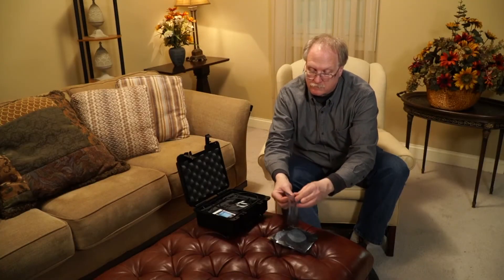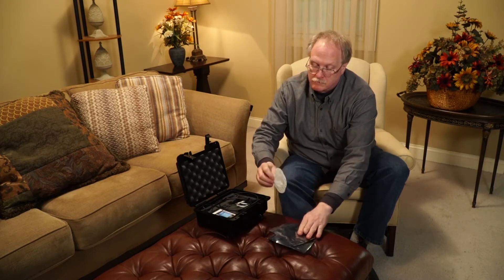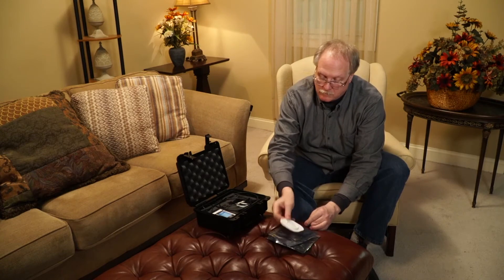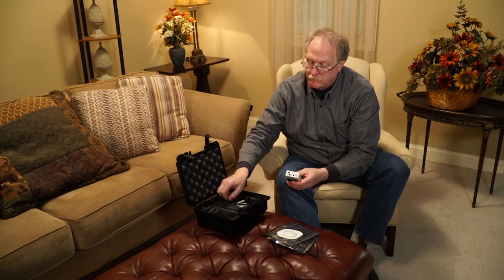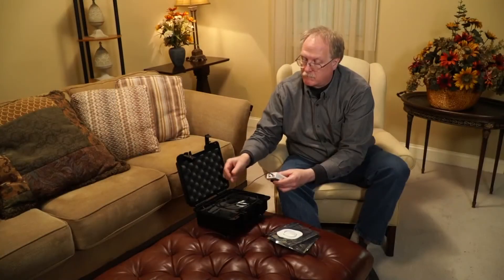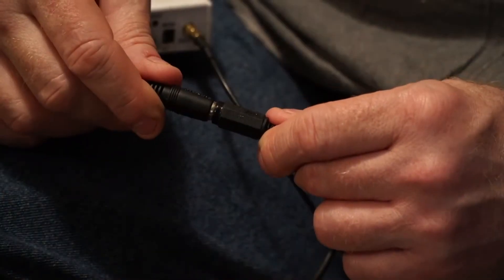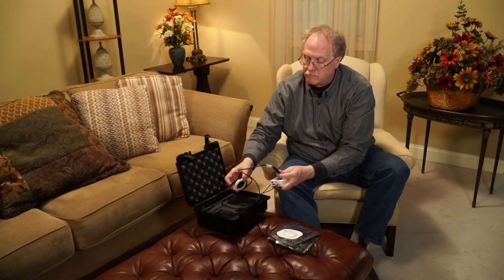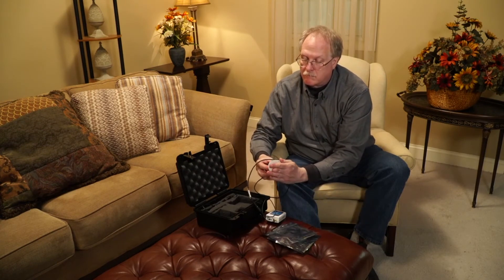Instead of taking the needle injection, the patient takes a patch out of a foil packet. The foil packet is kept refrigerated until the day of use. The patch contains up to 150 units of Lispro insulin. A lead is connected to the control unit, and on the other end to the transducer coupler, which snaps into the patch.